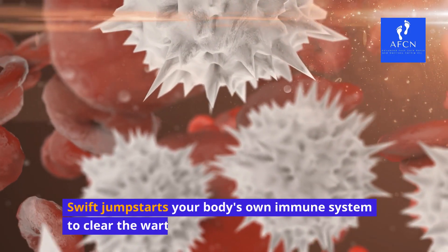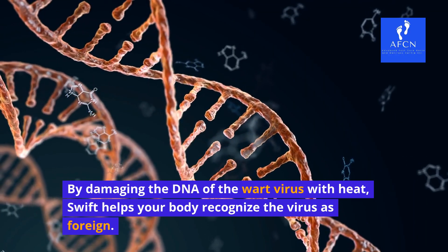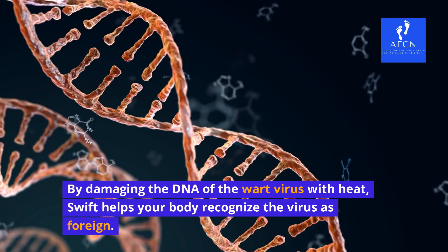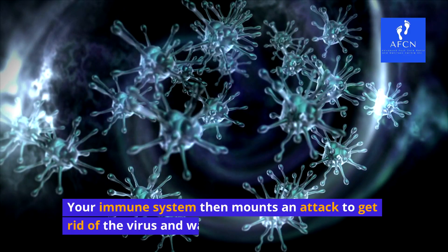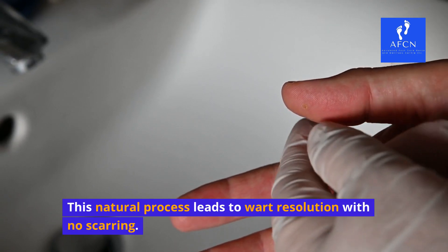Swift jumpstarts your body's own immune system to clear the warts. By damaging the DNA of the wart virus with heat, Swift helps your body recognize the virus as foreign. Your immune system then mounts an attack to get rid of the virus and wart. This natural process leads to wart resolution with no scarring.